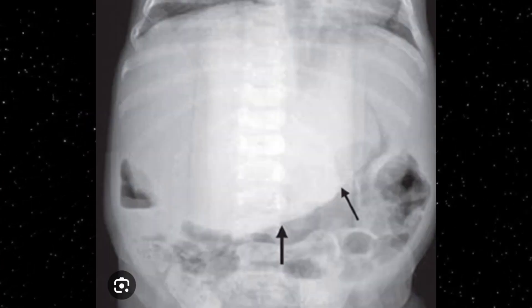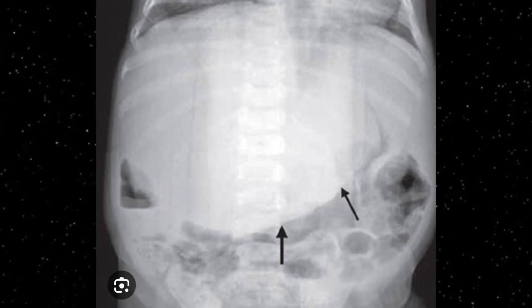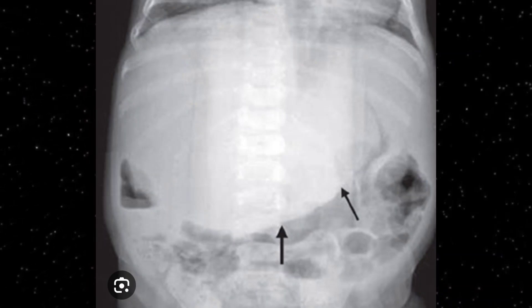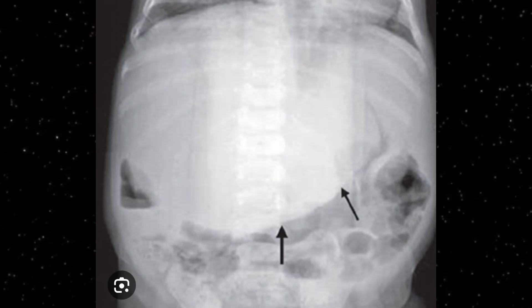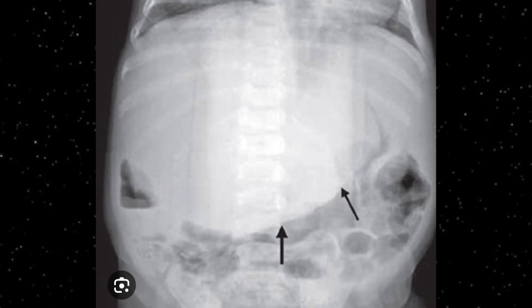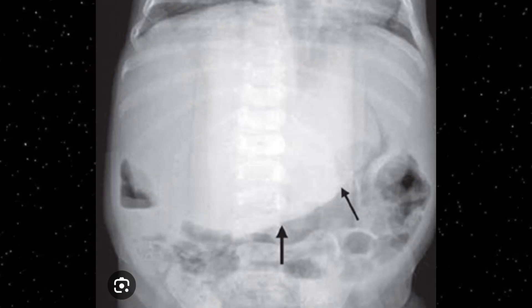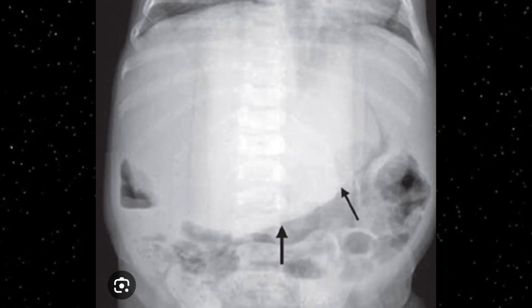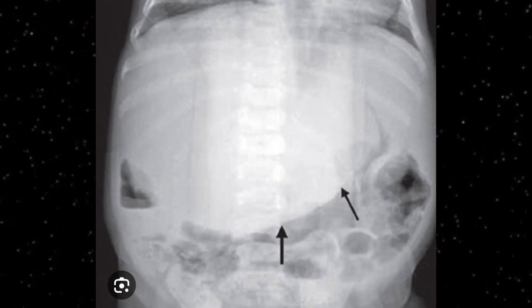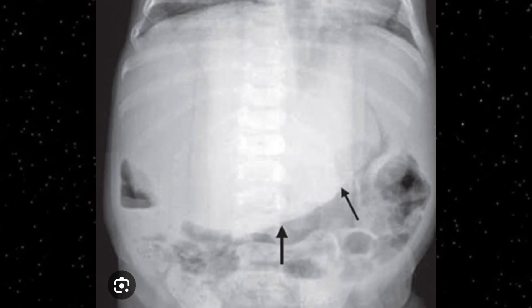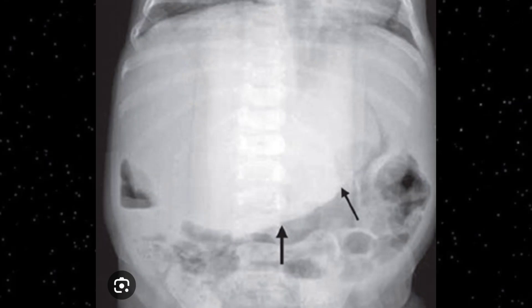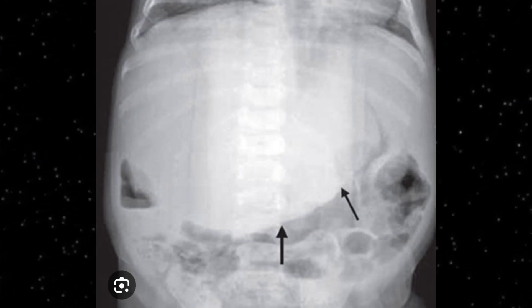Hepatoblastoma is a childhood malignancy seen in children less than three years of age. Confirmation can be done with abdominal x-ray, ultrasound, CT scan, MRI, and scintigraphy. On this abdominal x-ray you can appreciate a huge radio-opaque mass — the black arrows indicating its borders. It is a well-defined, round, radio-opaque mass pushing the intestinal bowel loops downward. This child is less than three years of age, so this is confirmatory for hepatoblastoma.